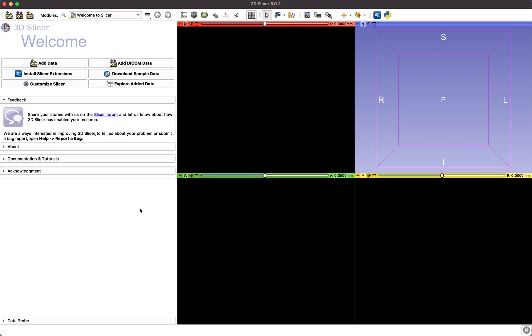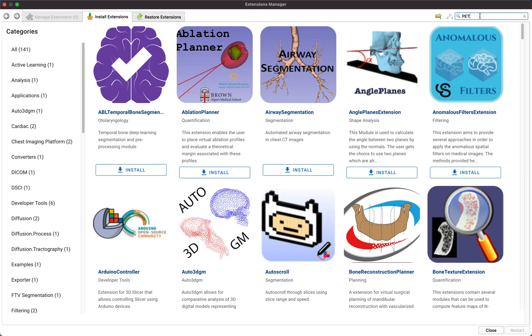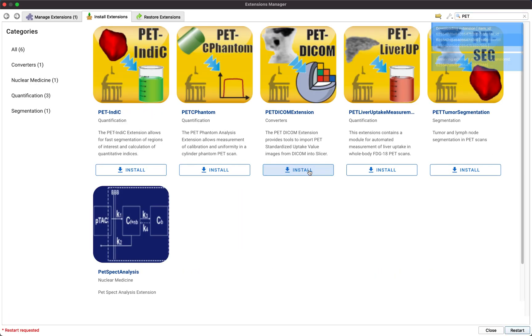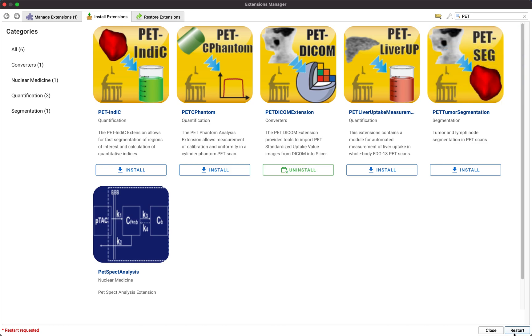From the 3DSlicer main window, navigate to the extension manager, then search for the suite of PET tools, select the PET DICOM extension for installation and restart 3DSlicer.